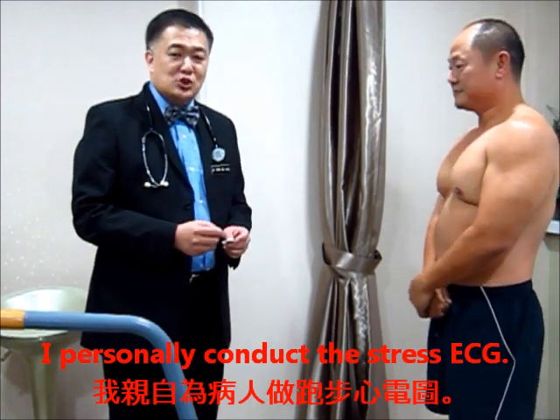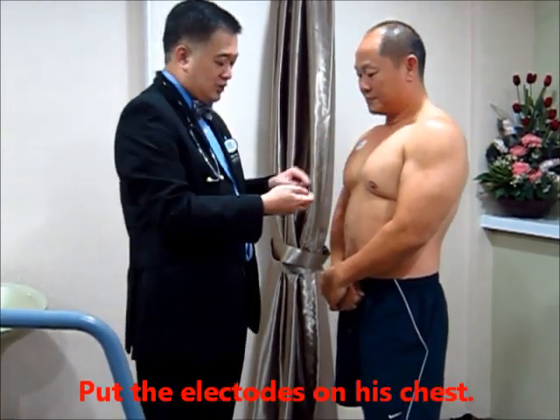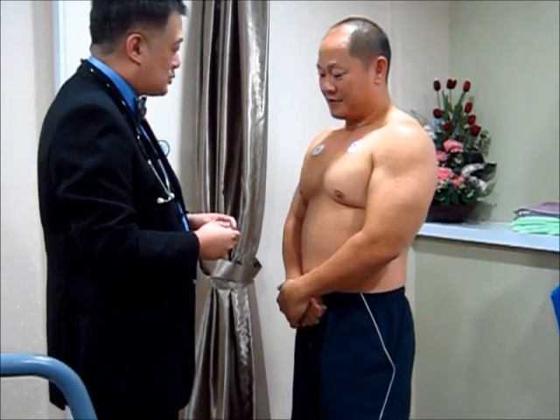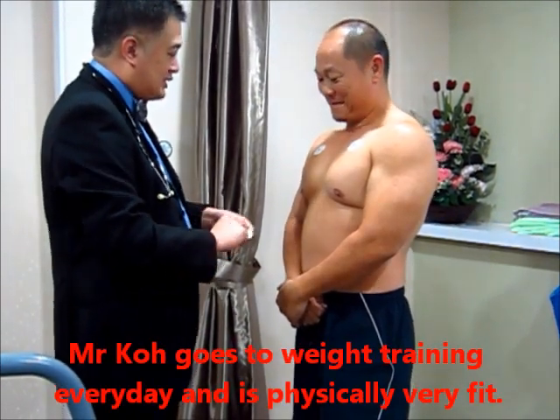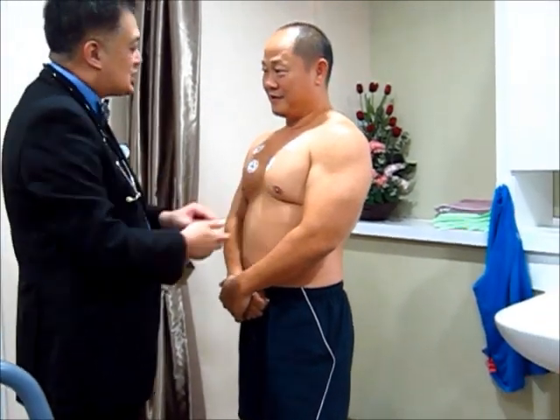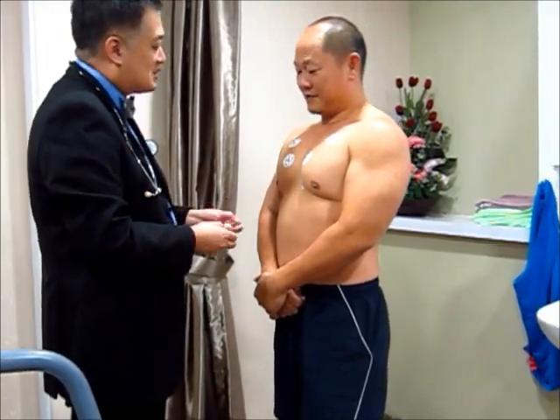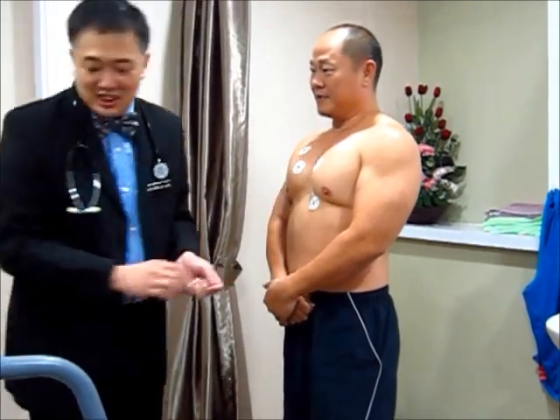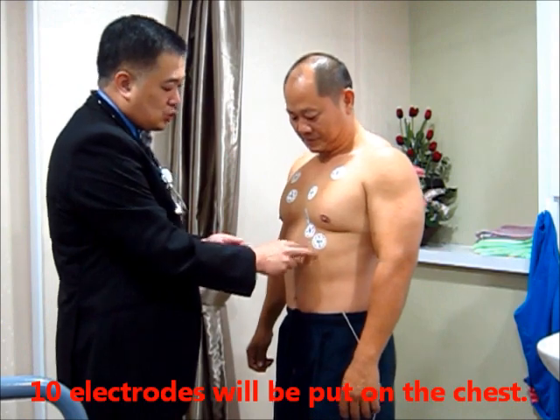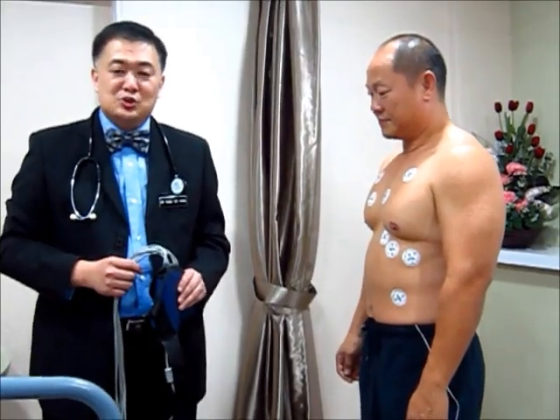I normally like to do this myself to ensure the quality of the result. I will put the electrodes on the chest of the patient. The electrodes are placed on different parts of the body and this helps to detect the electrical activity from the heart, sensing it from different directions.